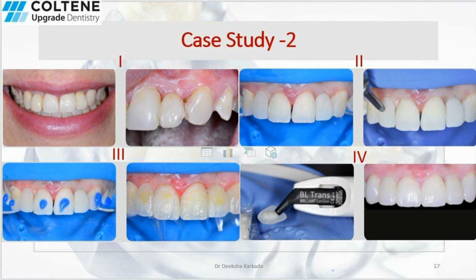There was a defective all-ceramic adhesive bridge, so the missing lateral incisor was replaced by BRILLIANT Crios extension bridges. The composite pontics were conditioned with 50 micrometer aluminium oxide, and the remaining enamel surfaces were etched with phosphoric acid, and it was bonded to receive BRILLIANT Composite veneers.